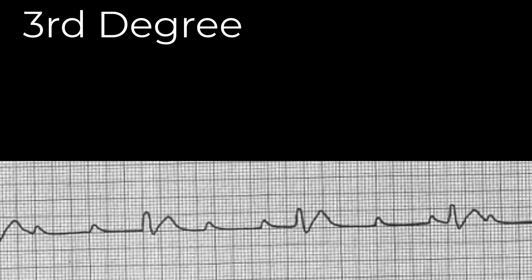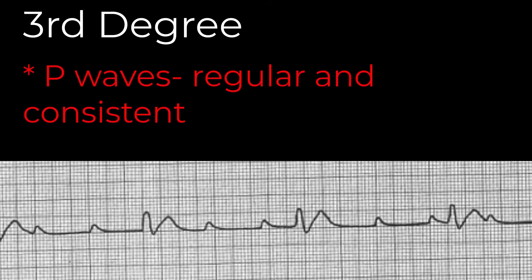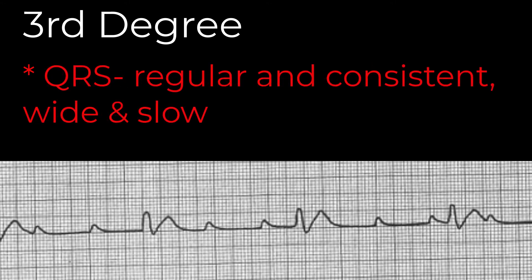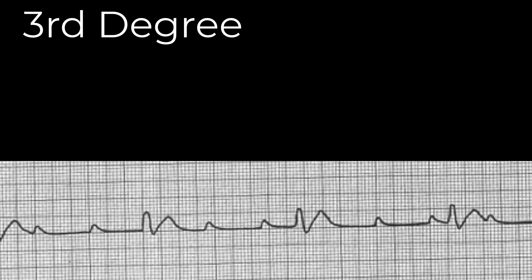We identify a third-degree block by noting a few key facts. The P waves are present, regular, and consistent. The QRS is also regular and consistent, and often those QRS complexes are wide and coming at a slow rate because they are originating below the AV node. This is also referred to as AV dissociation because there is no connection between what is happening in the atria and what is happening in the ventricles. When we analyze this rhythm, the P-to-P is regular, the R-to-R is regular, but there is no relationship between them. If you try to measure PR intervals, they will vary widely because those P waves are not producing those QRS beats.